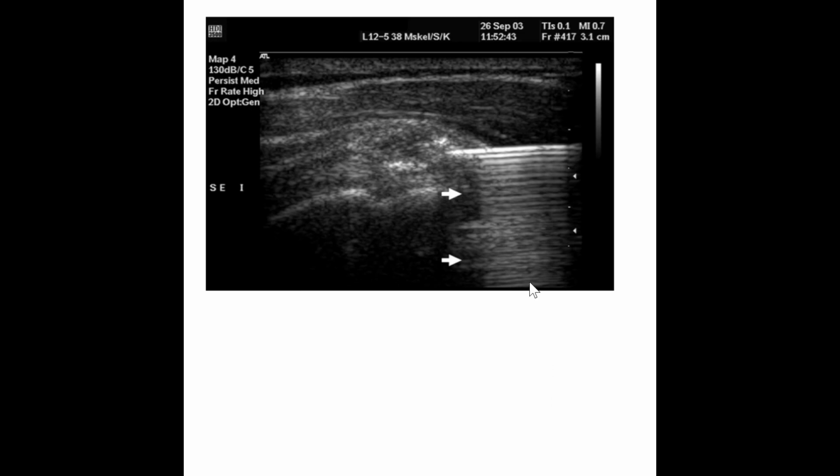This patient is having some sort of biopsy done. The needle is the first strong reflector, and this is the real one. Now the needle technically has two sides to it. These are hollow needles, so we're going to have sound bouncing in between the hollow part of the needle. And that is what we're seeing, these equal distance reflectors, because sound continues to bounce in between the hollow part of the needle. So it looks like a little step ladder, equal distance apart. We're noticing that we're getting some attenuation as we get deeper into the body because the sound is starting to weaken as it continues to bounce, and then it's parallel with the sound beam.